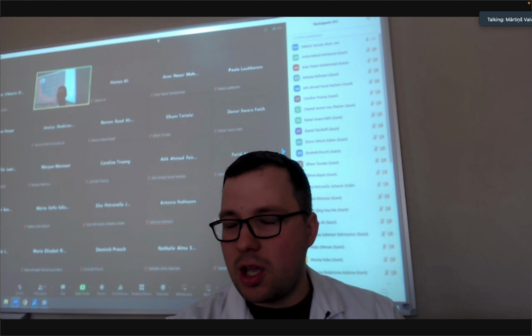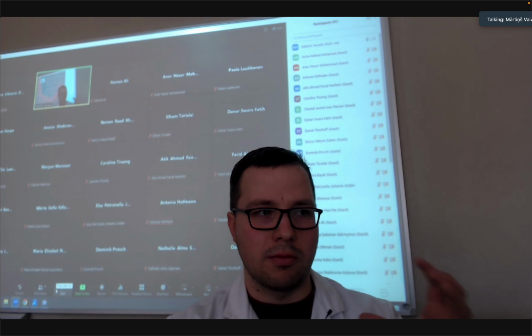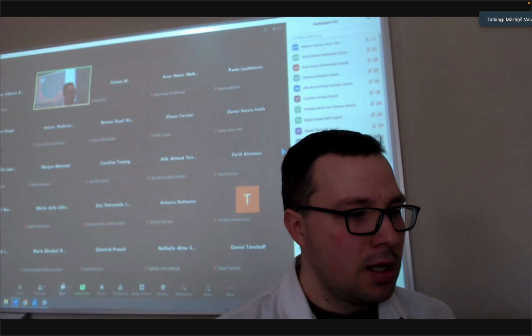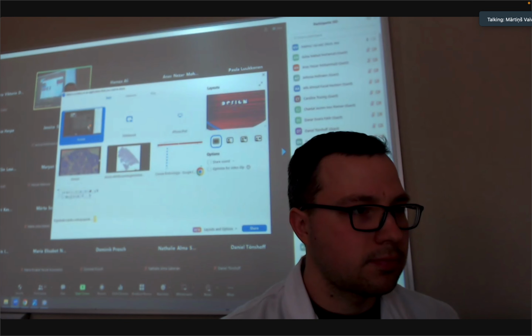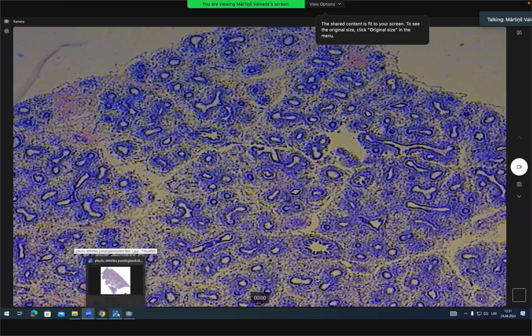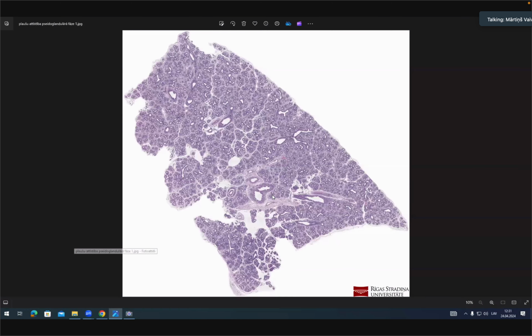First slide that we will check, lung development in pseudoglandular stage. So we will start with the respiratory system first because it's the shortest topic for this class. So lung development in pseudoglandular stage. I will share my screen with you also so we can see everything. So, as we can see in the slide, that's one way how to understand the general idea, what you might see also in the colloquium, but I will start with pictures again.